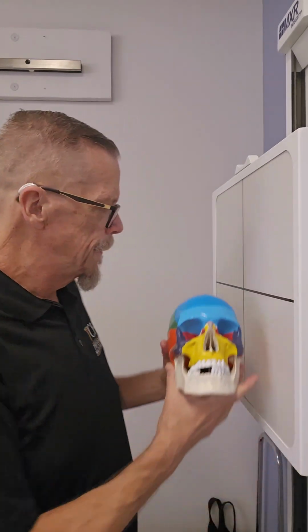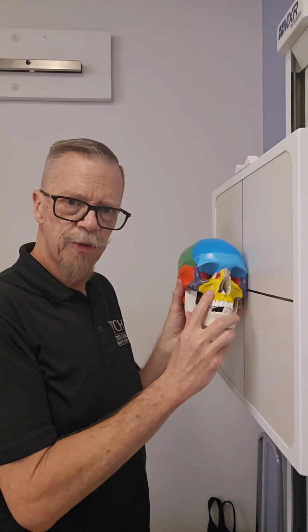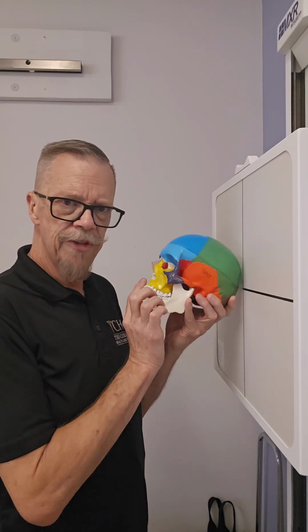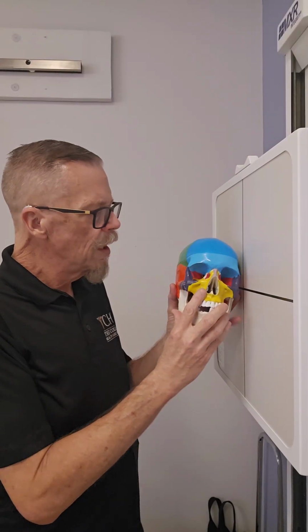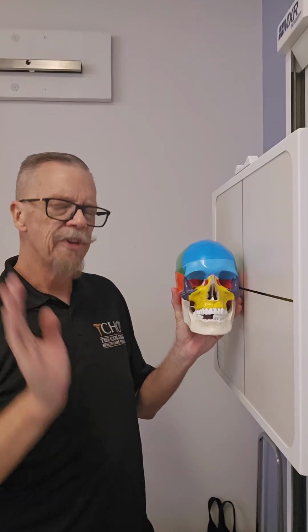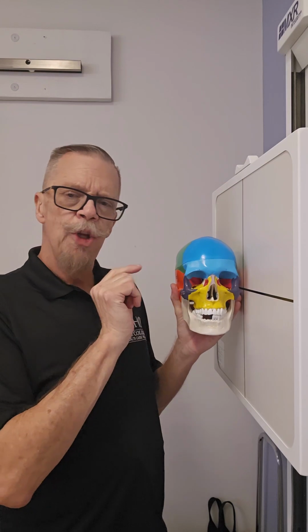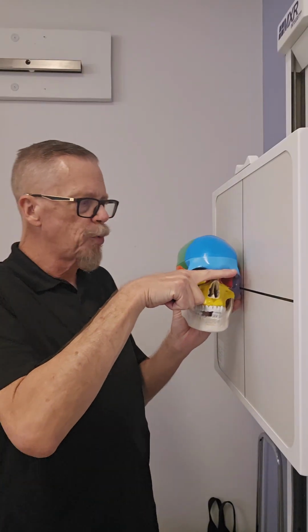All right, let's look at the lateral now. For the lateral, we worry about tilt more than anything. Remember, rotation is this way, tilt is this way. We do not want the patient's head tilted. For a lateral projection of the skull, facial bones, nasal bones, sinuses, whatever it is, you want the interpupillary line to be perpendicular to your IR. So the line right between your eyes, right between here.